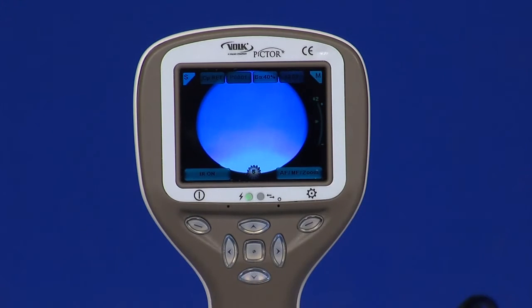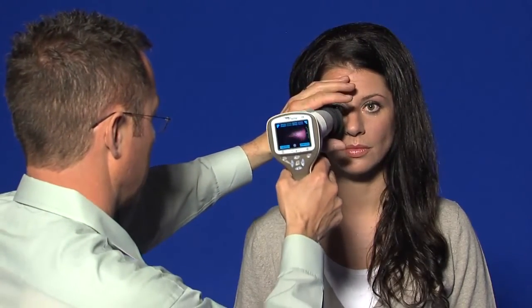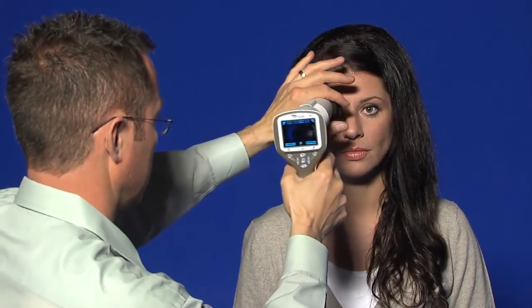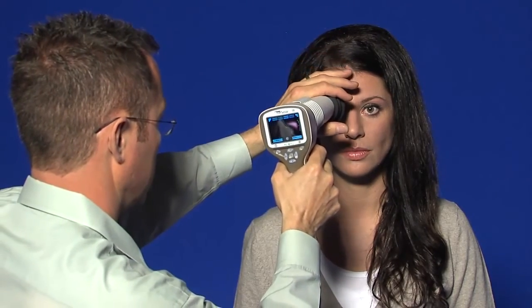Infrared intensity used for targeting can be adjusted from the menu. Setting the infrared to high is recommended. The camera is stabilized by keeping the outer side of the hand against the patient's forehead. If adjustment is needed, it is recommended to use the hand closest to the forehead to adjust the module.